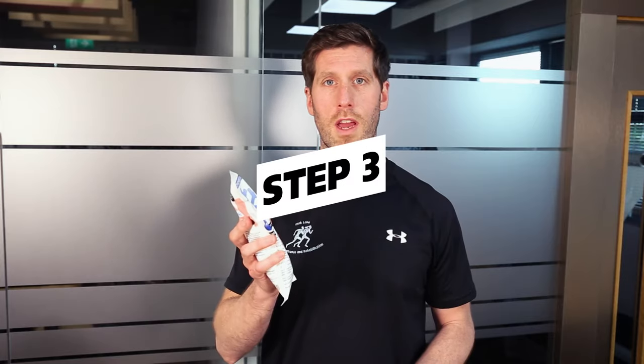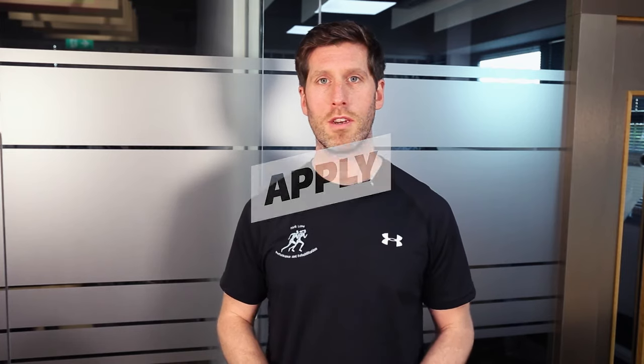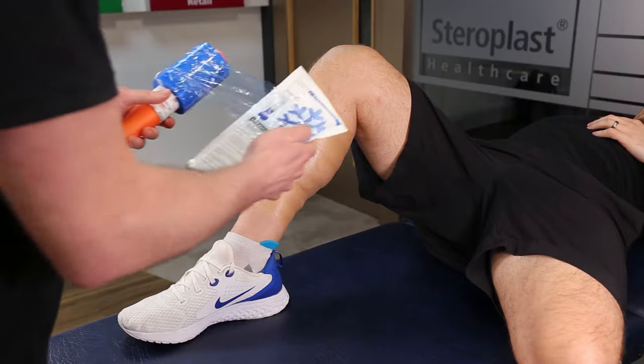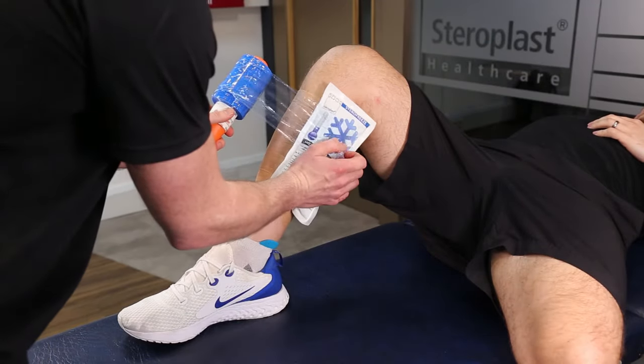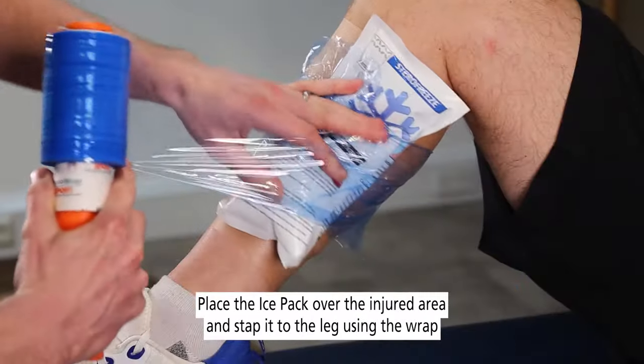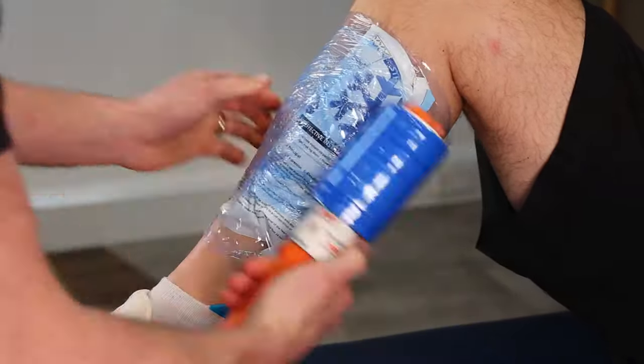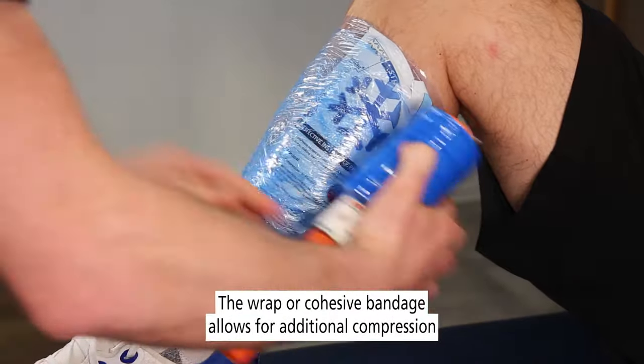Step three is the application of the ice pack itself. We're going to use some compression — you can either use cohesive bandage, or in this case we're going to use a physio wrap. We'll pop the ice pack onto the injured area and use the physio wrap to wrap around, creating compression.